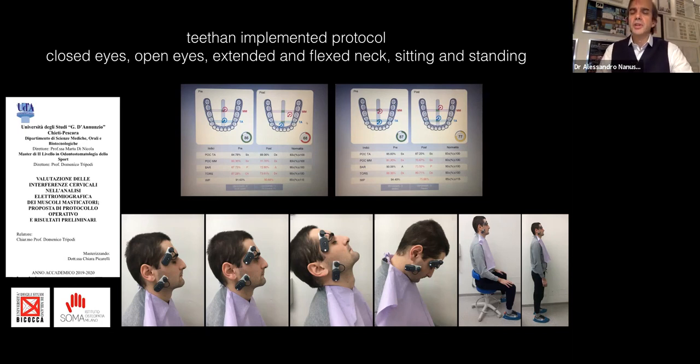We control also the effect of the aligners, invisible aligners. Frequently, we will find that invisible aligners are not balanced. Sometimes some patients need me to put some resin. Okay, I can show it to you now to balance the aligners.